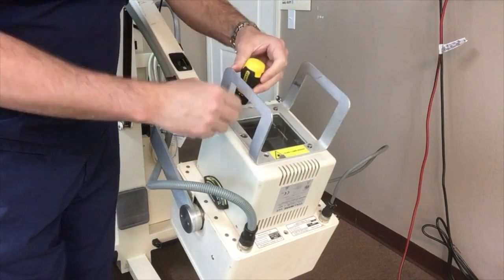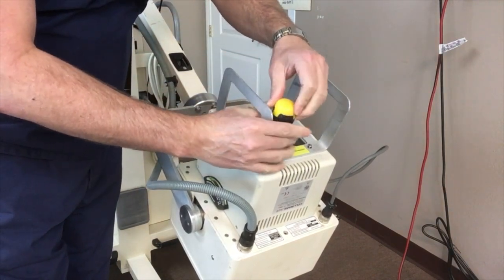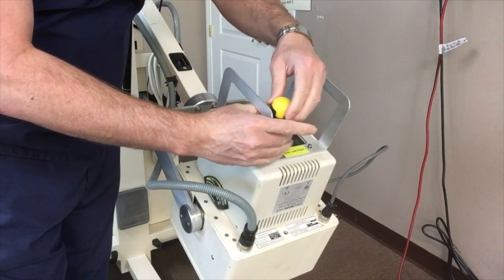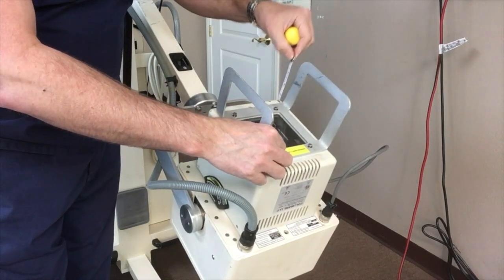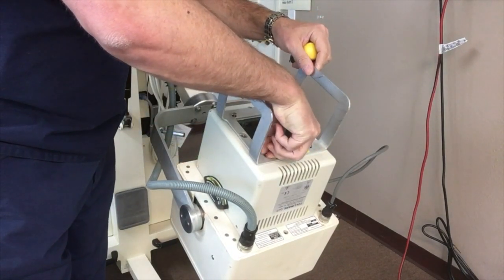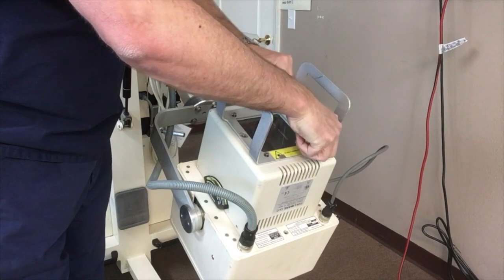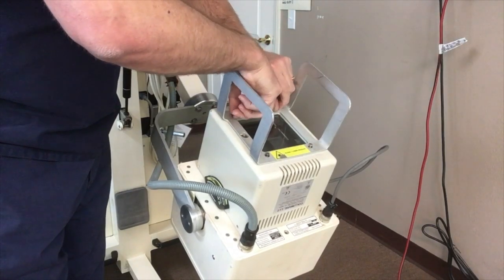The collimator housing is lined with lead foil to shield it, and the built-in tape measure is mounted to that lead foil. So when removing the collimator housing, you don't want to tear the lead foil or knock your tape measure out of place.